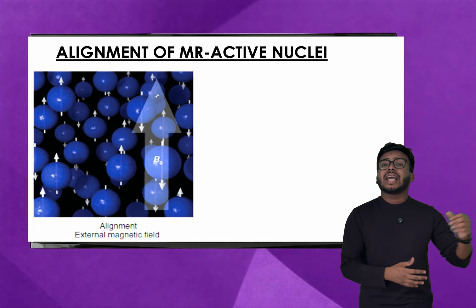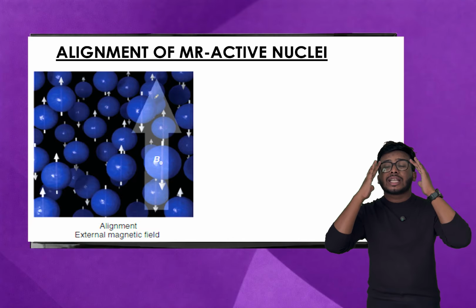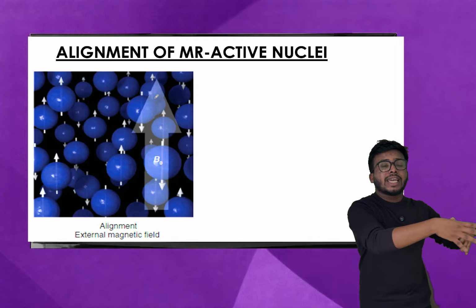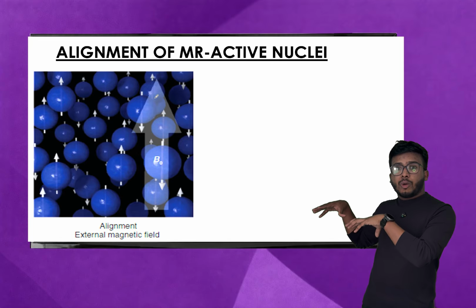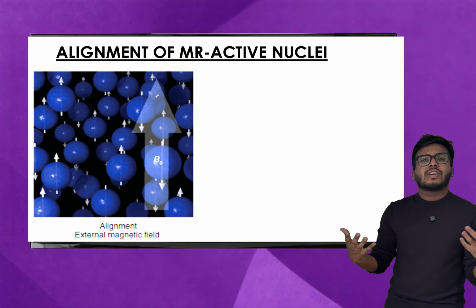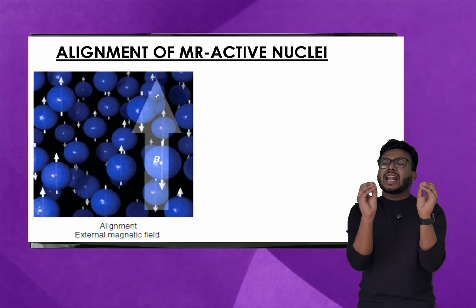How? Same way as a classroom. If the teacher comes into the classroom, what happens? If the students are under the influence of a teacher in a classroom, they will align parallel towards the direction of the teacher. The students walking here and there will come and sit towards the direction of the teacher. Those who are standing or sitting over the table will sit towards the direction of the teacher. But a few students, some crazy students, will not mind whether the teacher comes or not. They will continue their business. They will be turning back and talking, gossiping. So it will be a smaller population, right?